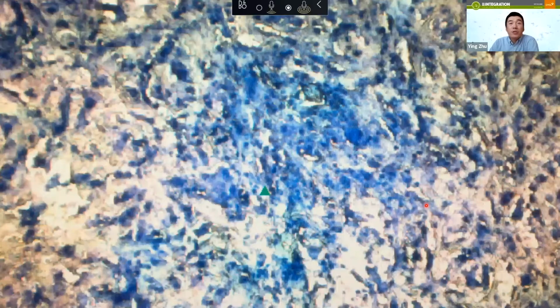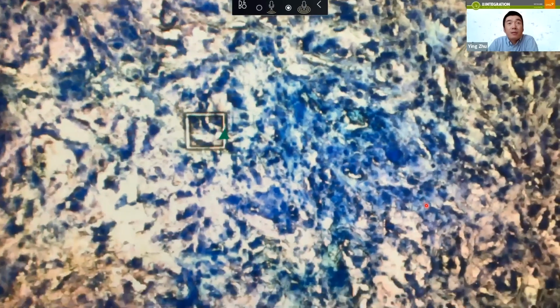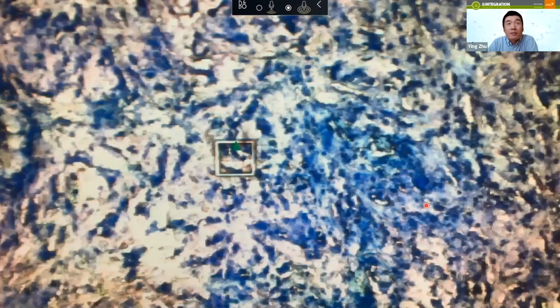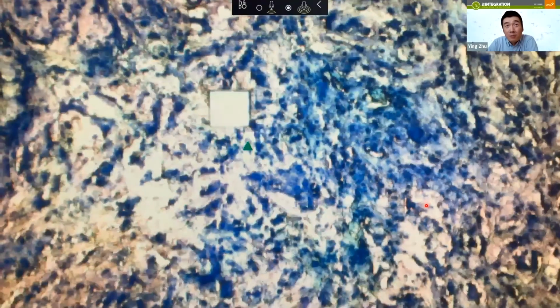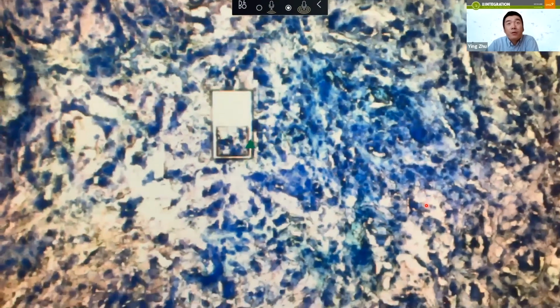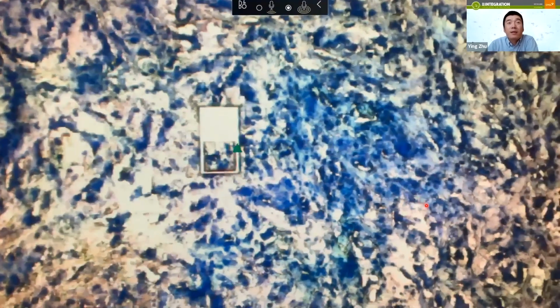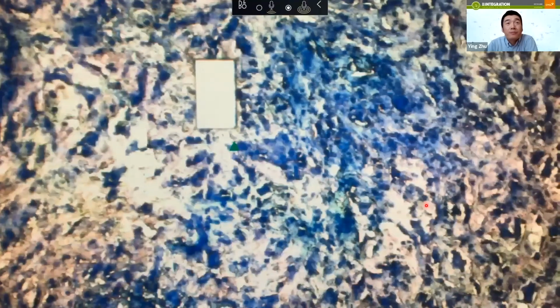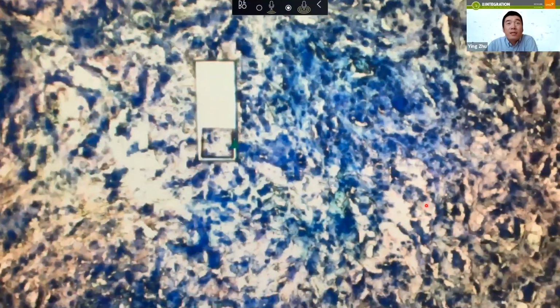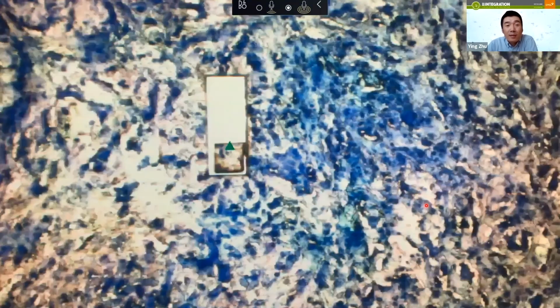It's the same video shown by Ryan. It just shows you how the LCM works. The first step is laser ablation, isolating the pixel or box from the tissue. We usually do one or two laser ablations to make sure it's completely isolated from the tissue. Then it applies a laser pulse to the center or the edge of the tissue. It will shoot the tissue into the collection device.